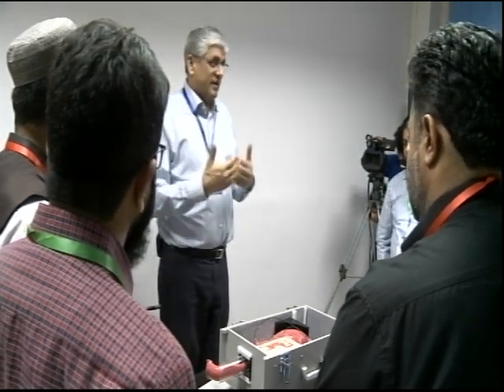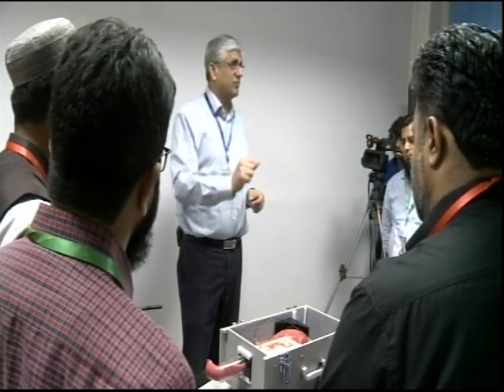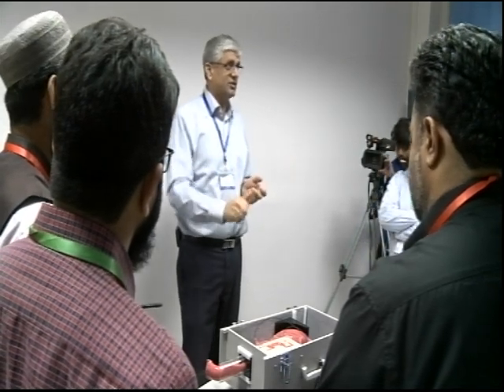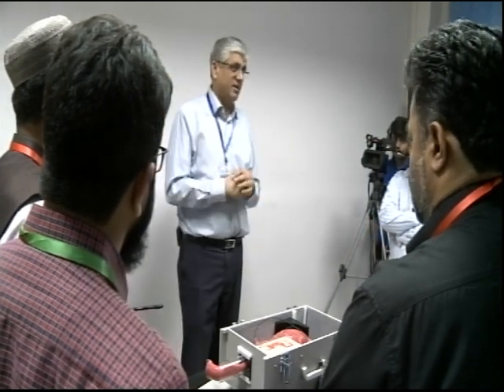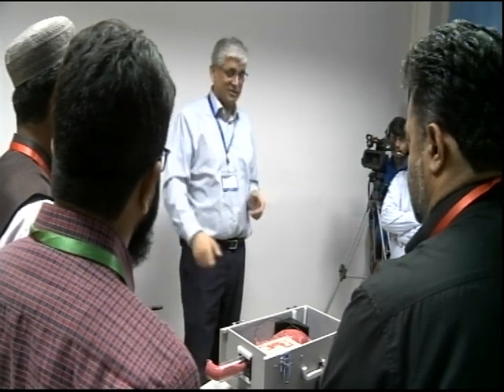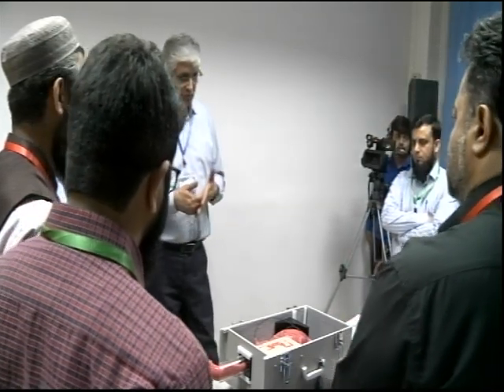Propofol in our unit is done by the anesthetist, so we don't get involved there. I know there are centers in Pakistan who just give propofol like this. I've been told it's very simple: why do you get the anesthetist? You can just put it in. And I've seen patients with an anesthetist actually go down, and I'm too scared. I have enough complications with my procedures. I'm really not interested in having more complications from anesthesia, especially on my account. So this is what we do, sedation.